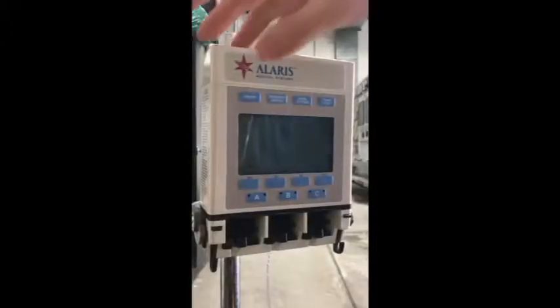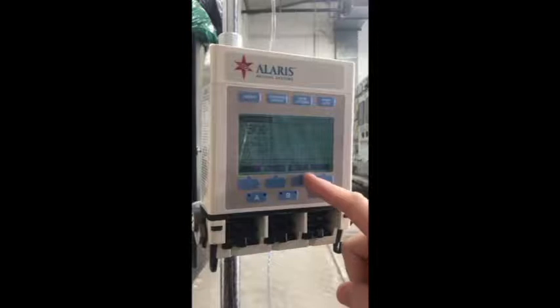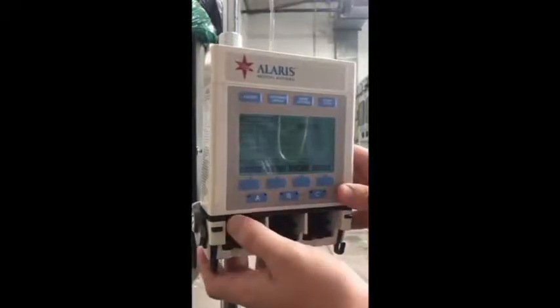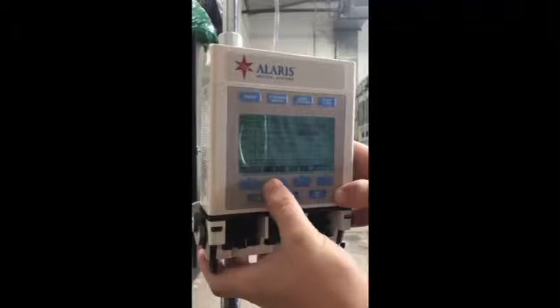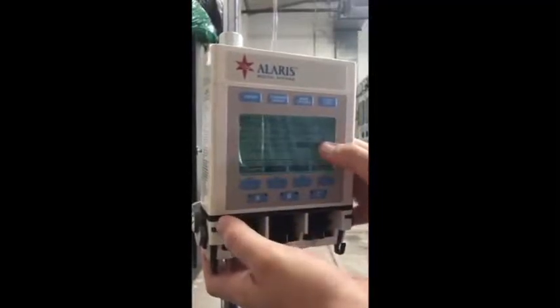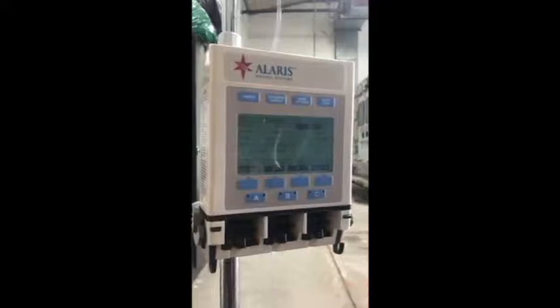Now that we have our tubing set up, we hit the on button. We can see that it is in general purpose 2. And then we can set. So we're going to do 100 mLs per hour. We have a 500 milliliter bag, and our volume that we've already infused is 0. So we are set.